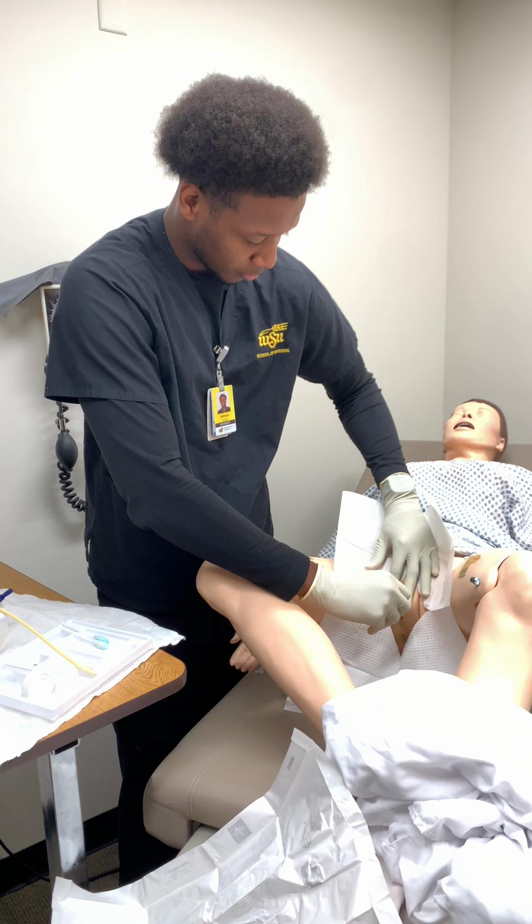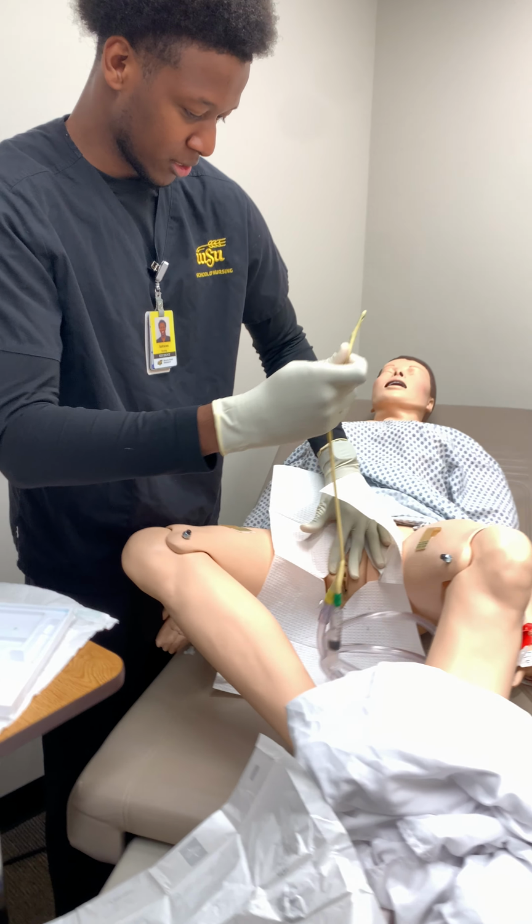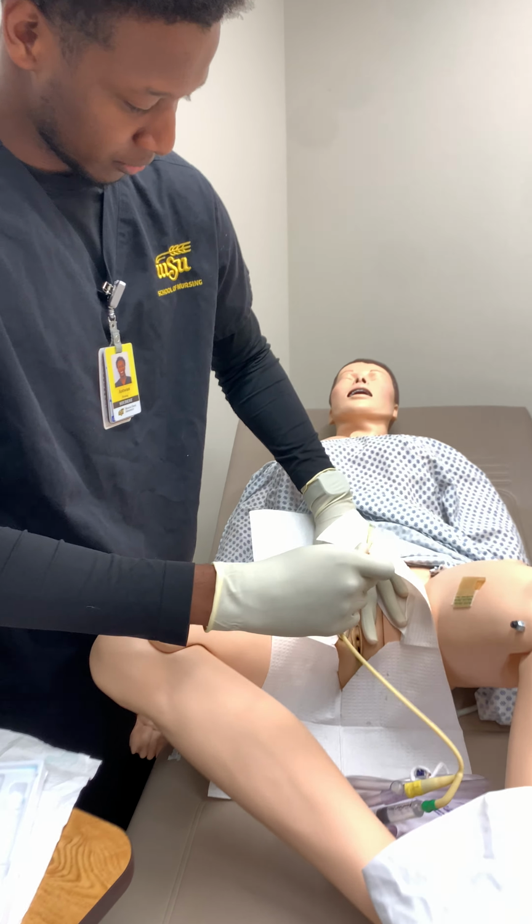I'll bring the Foley over. Now this hand will stay sterile and I will not break sterility. So I'll insert this until I get a flash back, and after I get a flash of urine, I'll insert it 2 more inches. So I'll go, and I will insert it into the urethra.